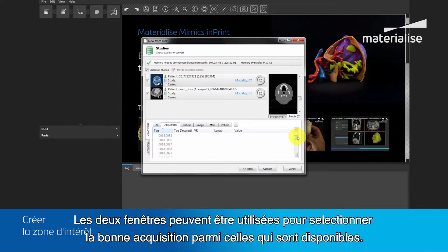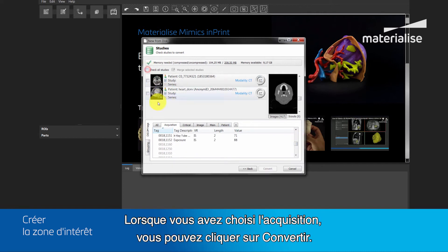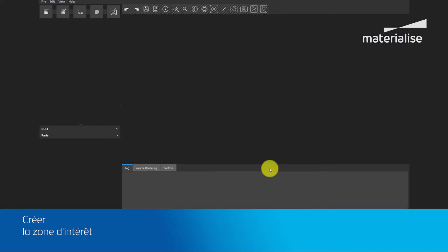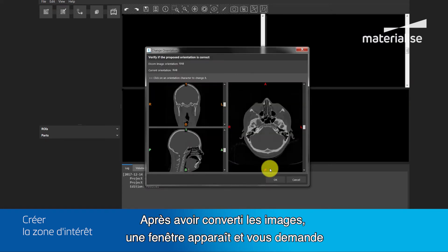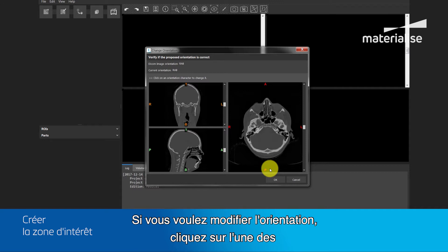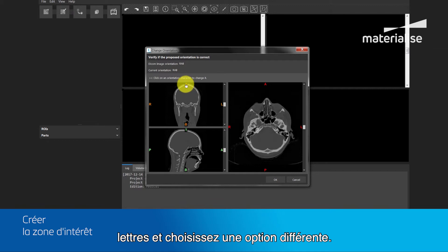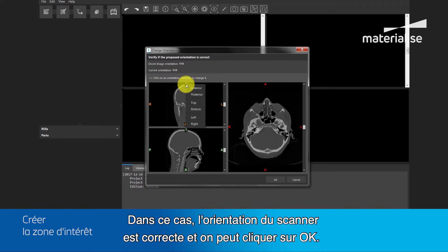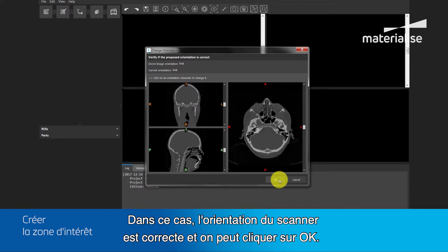Both windows can be used to select the right study from the available studies. If you have selected the right study, you can click Convert. After converting the files, a window will pop up asking you to assess the orientation. Should you want to make a change in the orientation, left click on the letters and choose a different option. In this case, the orientation of the scan is correct and we click OK.